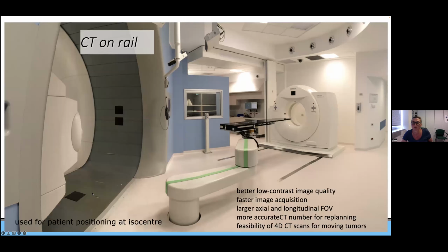So this is a laborious procedure that does not always work, and it is very difficult to implement in the workflow. So an alternative, which was actually one of the first solutions for image-guided radiation therapy, was the so-called CT on rail, where the bed of the patient is mounted on a robotic system and moved from the actual treatment system to a CT system, a high quality CT, not Cone Beam CT, which is low resolution, that is mounted on this rail. It can be positioned at the so-called imaging isocenter position.